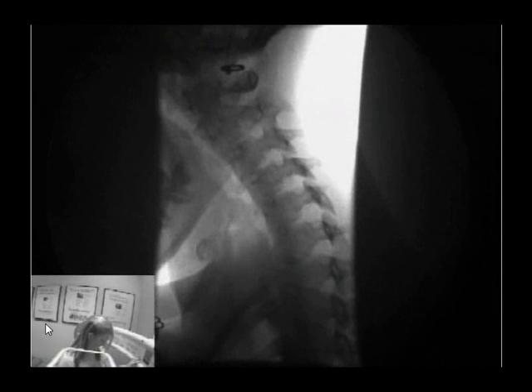The next view we're going to be looking at is an oblique cervical flexion extension — an actual oblique flexion extension view. I know we're not taught this in school, but in the DMX world it's one of the most important views, because we can see the patient in the left-hand corner. As she's standing at a 45-degree angle to the tube, she's bringing her chin to her chest. We can see right at the facet joints if they're gapping open.